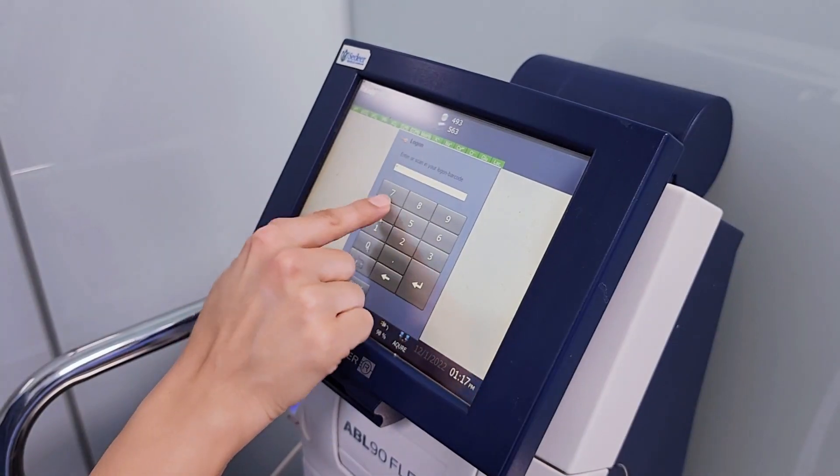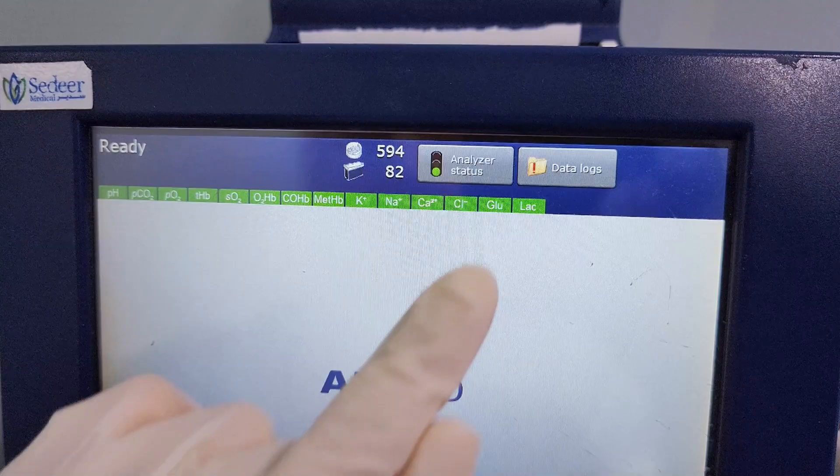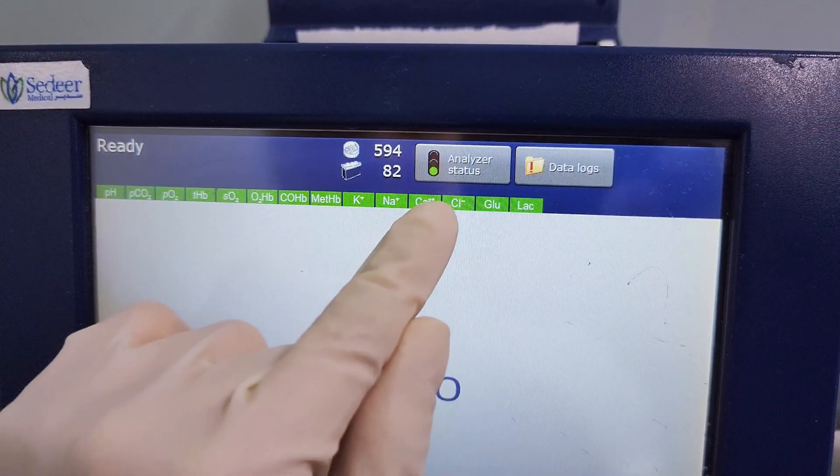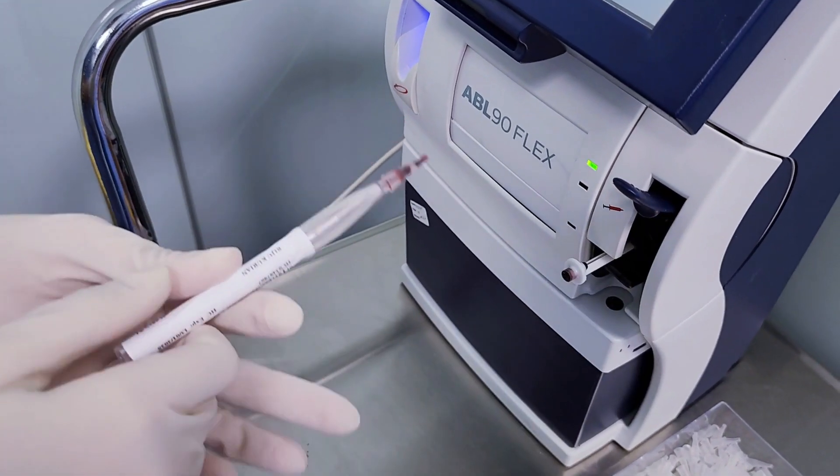Log in with your personal logon code or scan your ID. Check the analyzer status. Lift the inlet to the desired position mode — capillary mode or syringe mode.